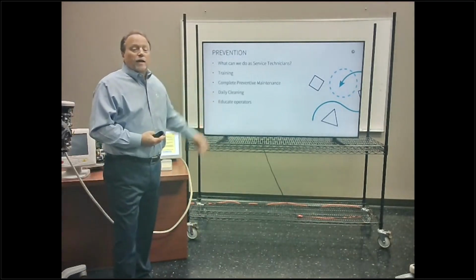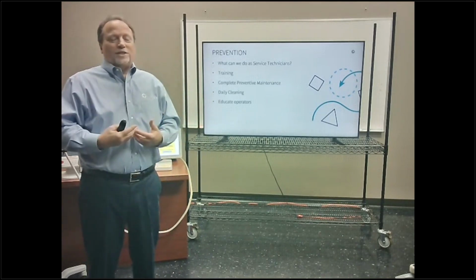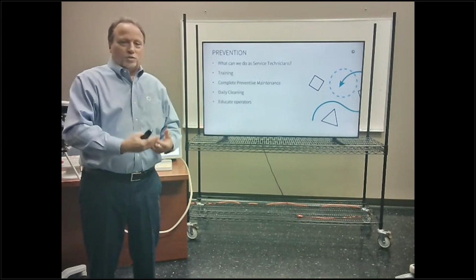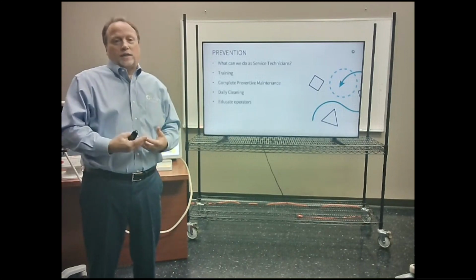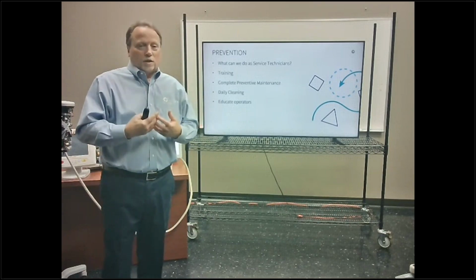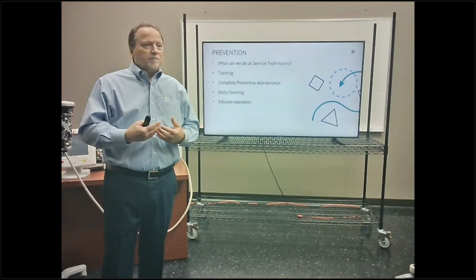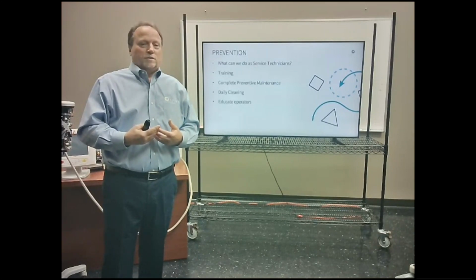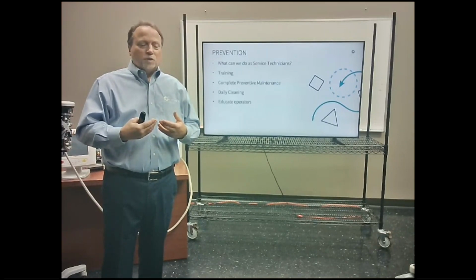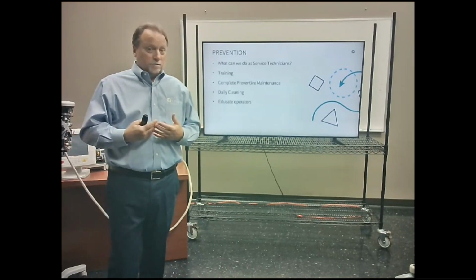Daily cleaning. Train the CT techs, the MR techs, the angio techs to do daily cleaning. Daily cleaning will save a lot of frustration. When you do a PM, 75% of the PM is actually cleaning. There's no reason for that. Okay?